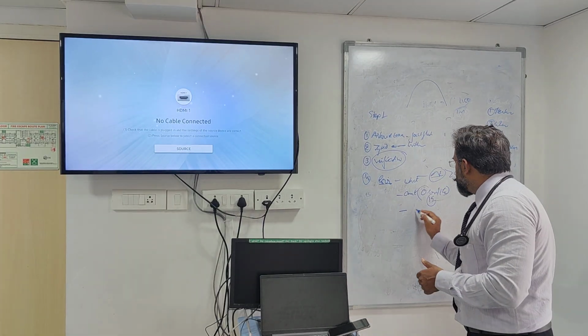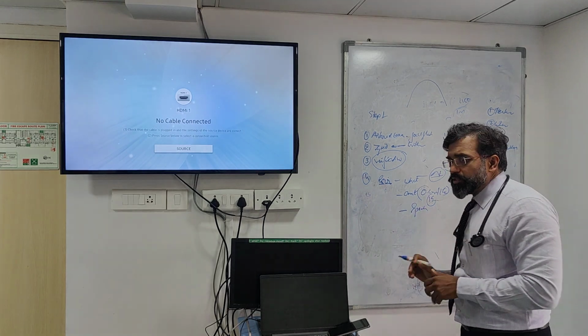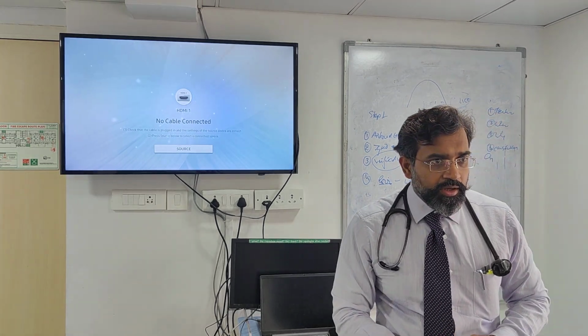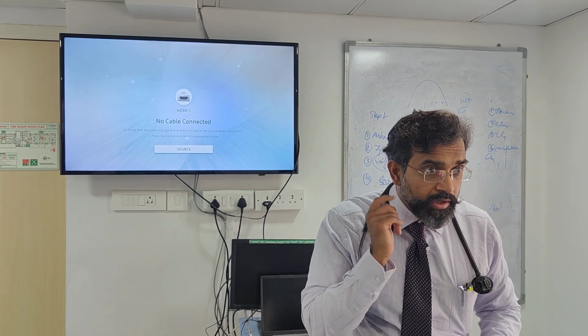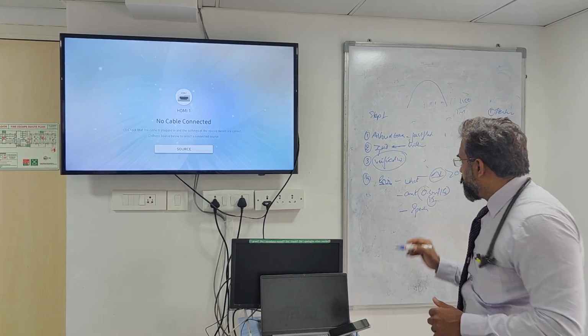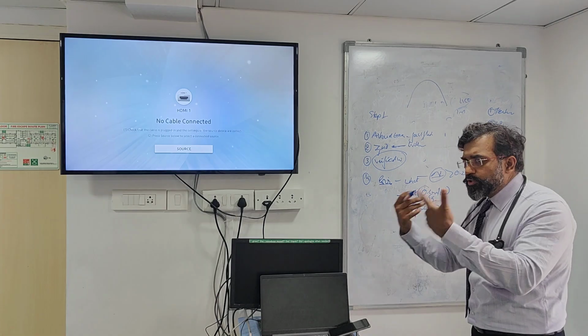Next comes the speed. The speed here is very important. It has to be somewhere around 2 ml a second. It has to be. So on an approximate level, less than 8 seconds, it should be inside.